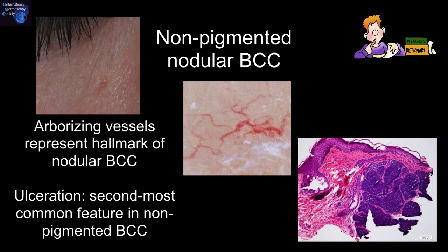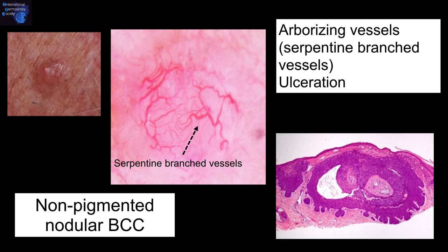Non-pigmented nodular basal cell carcinomas: the arborizing vessels — the serpentine branch vessels — represent the hallmark of nodular basal cell carcinoma. The second most common feature is areas of ulceration.